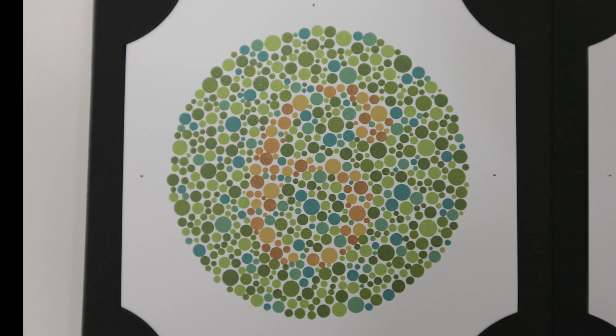Plates 8 through to 13 are what's called a vanishing design, so people with good color vision can see something, but people with color deficits can't see anything. We've got plate number 8 here, and you should be able to see something — I'm going to leave it to you to read what number you see. But people with a color vision deficit won't be able to see anything.